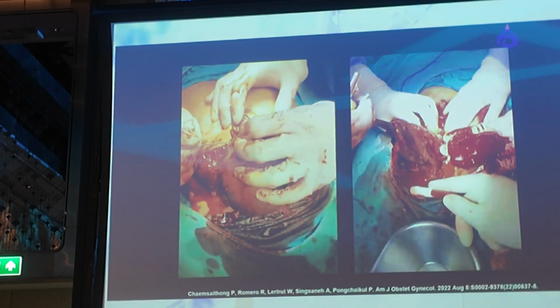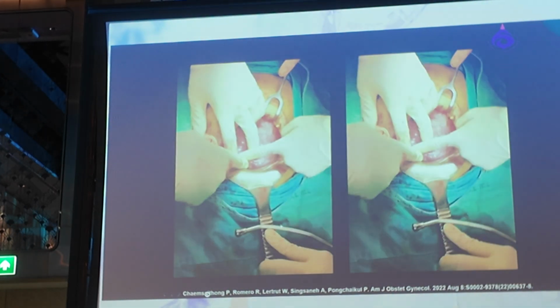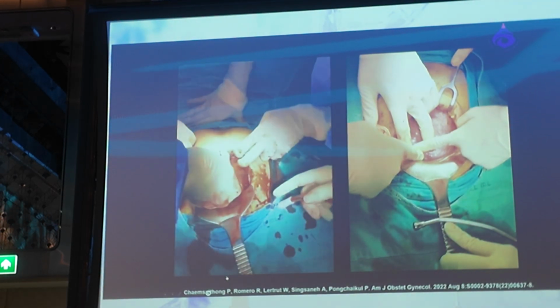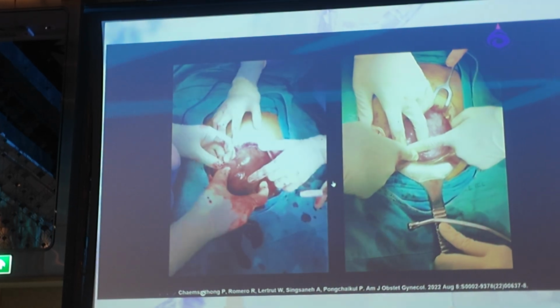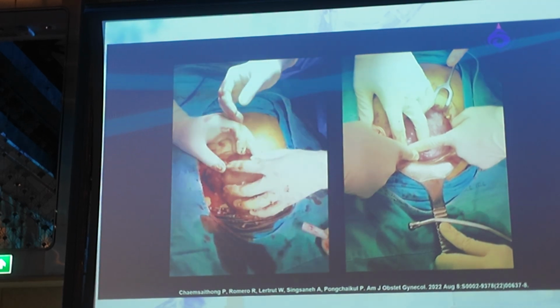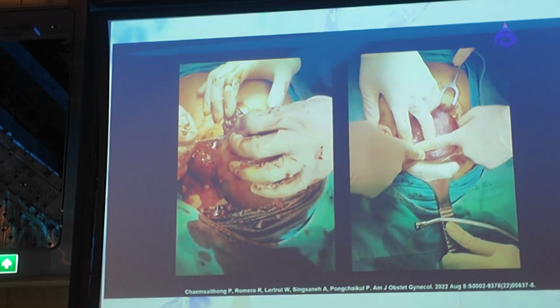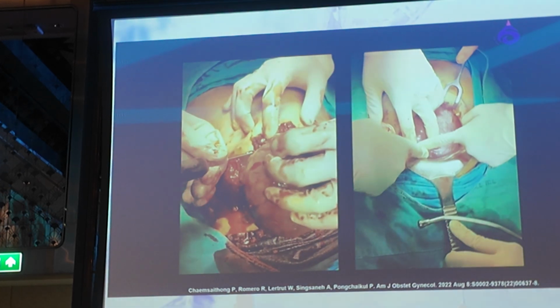Let's look to the left. Well, look at the color of the fluid.